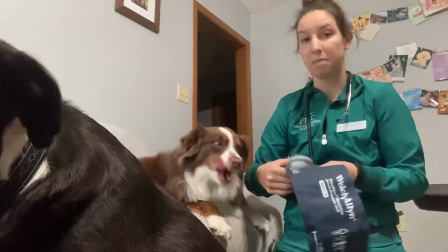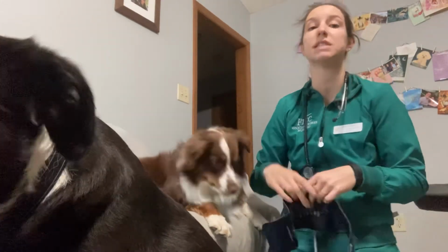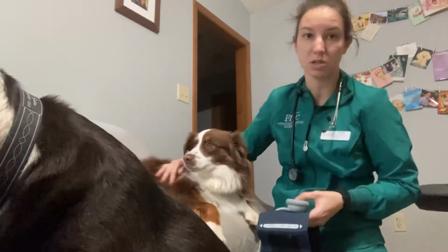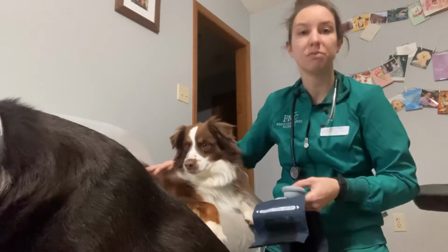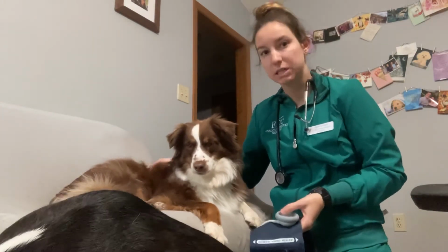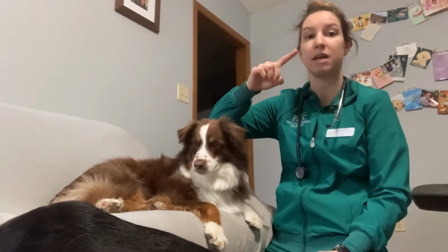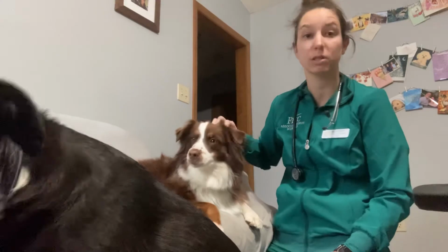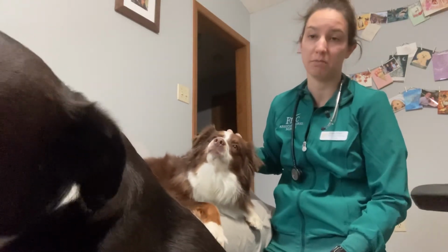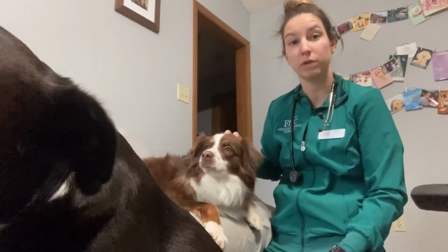It's supposed to take up about 40% of the arm's circumference in order to be deemed an adequate fit. You want it snug, but not overly snug, and we want the right fit so as to not distort our numbers. As you inflate the cuff, you go about 30 millimeters of mercury above the expected blood pressure, and you let it out with the needle falling at about 2 millimeters of mercury per second. We don't want to go any faster than that, again, so that we can get the most accurate reading possible. For an adult, our average blood pressure is about 120/80.